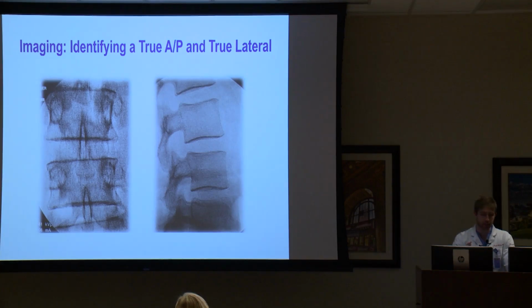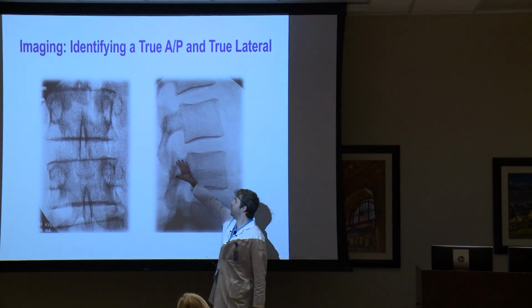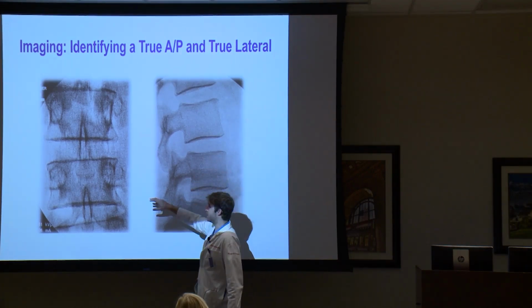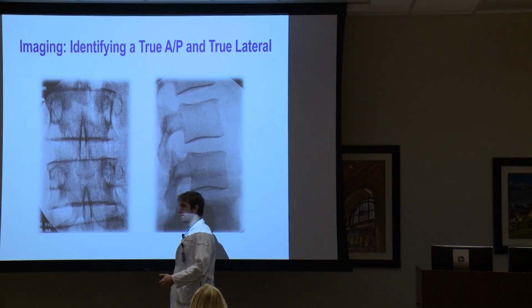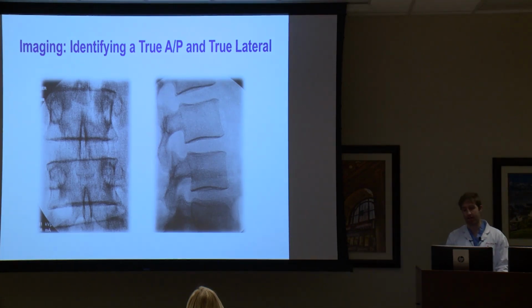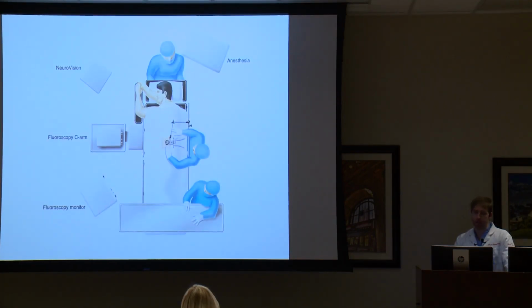So you can see straight on, you can see the pedicles here. There's no double lines anywhere. You can see the end plates, you can see the pedicles here. Nice crisp end plates right there. So you know exactly what you're getting when you're getting it. Now, if I ever had a picture this clear, we could probably go a little bit faster than the way I go. But here is the way it usually goes. So you have the patient facing away from you. You have x-ray come in.